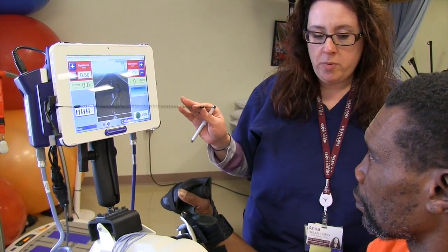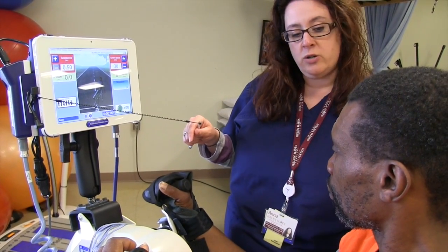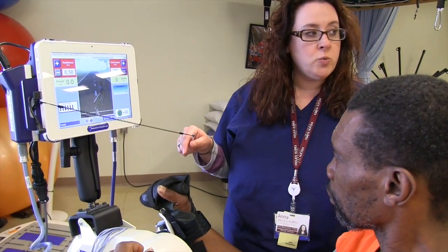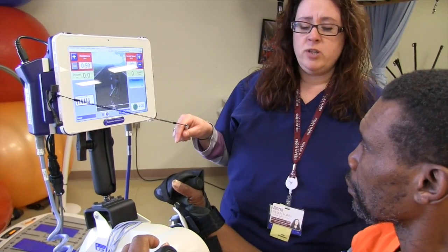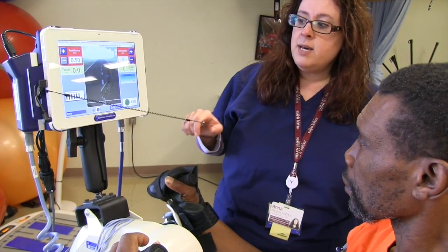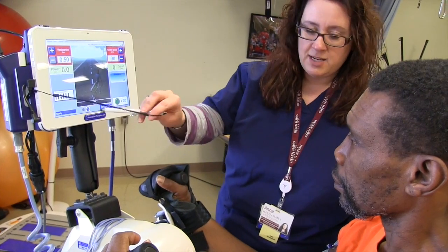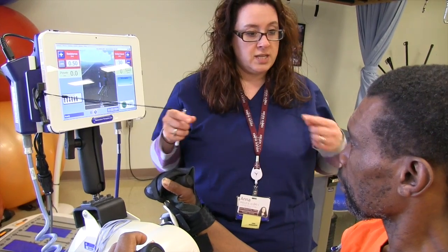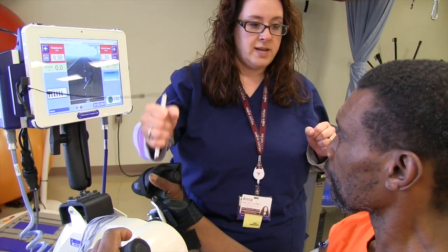So what's going to happen is we do a warm up first. The shoulder and your shoulder blade back here — the muscles back here — you'll feel those go on first. Those will stay on the whole time, and they're on for a few minutes, because they really work to stabilize. You need to stabilize the shoulder before we actually get it moving. Then after that, when it says active therapy, you'll feel it — you can't mistake it — that's when you're going to start feeling these muscles start cycling with the e-stem, because it's going to stimulate you cycling, and that's when it kicks in.